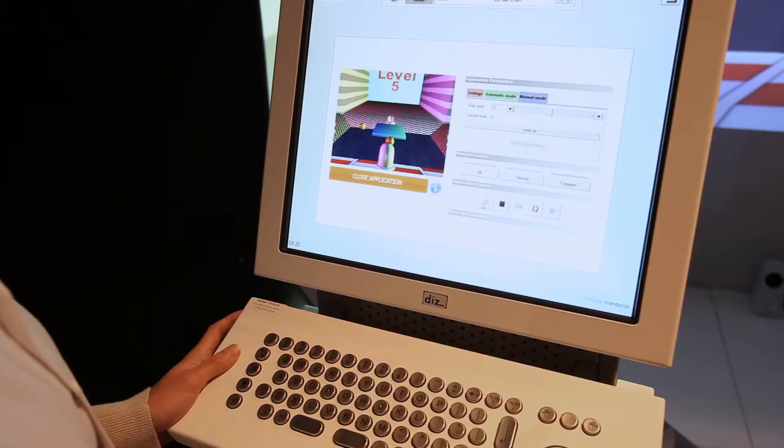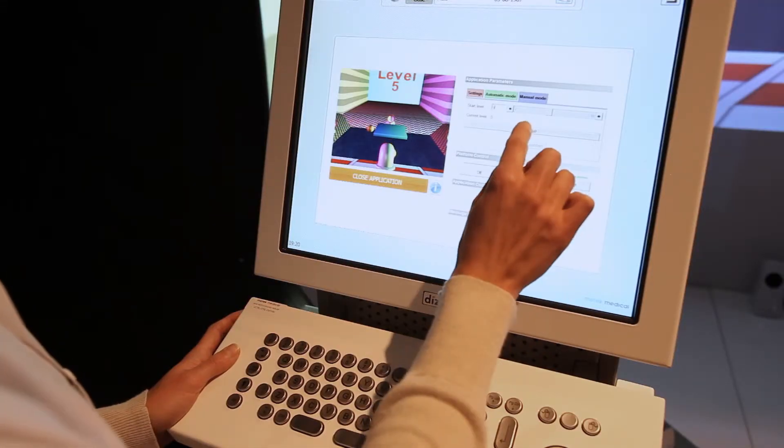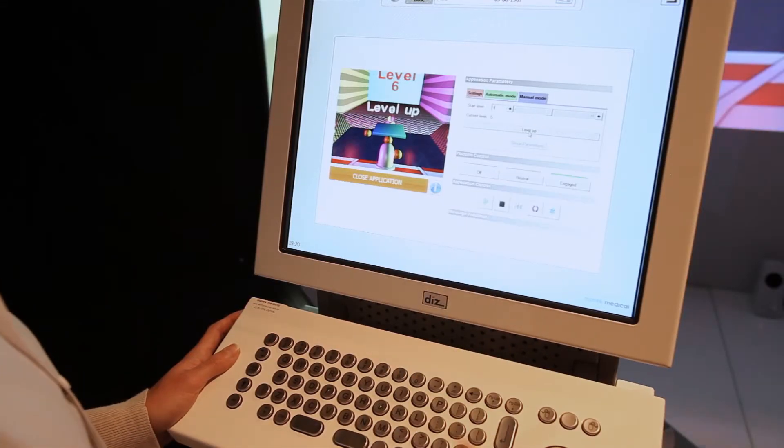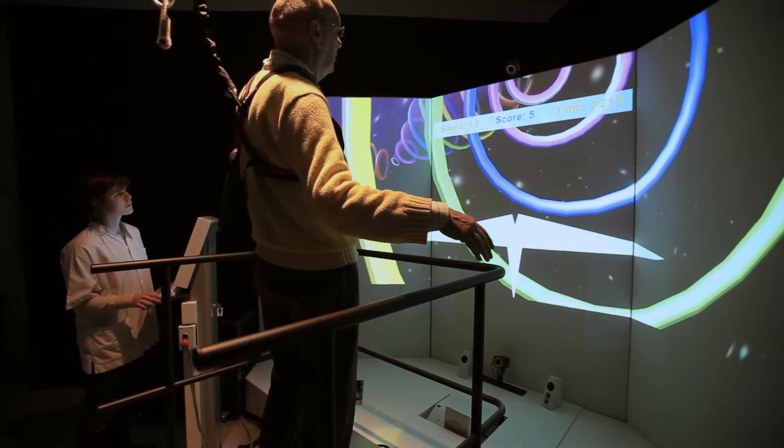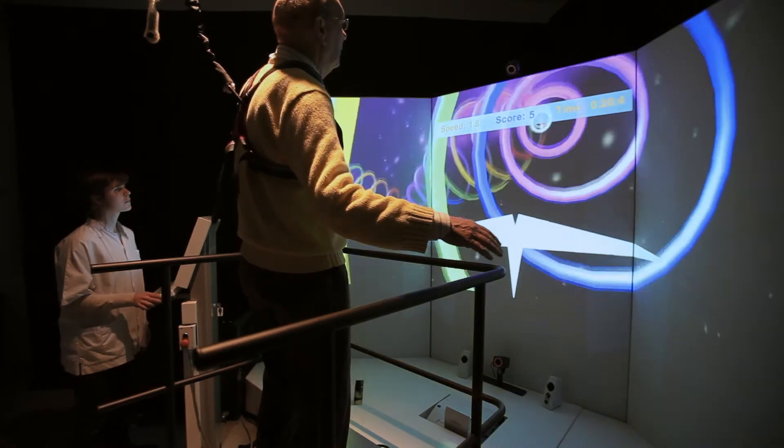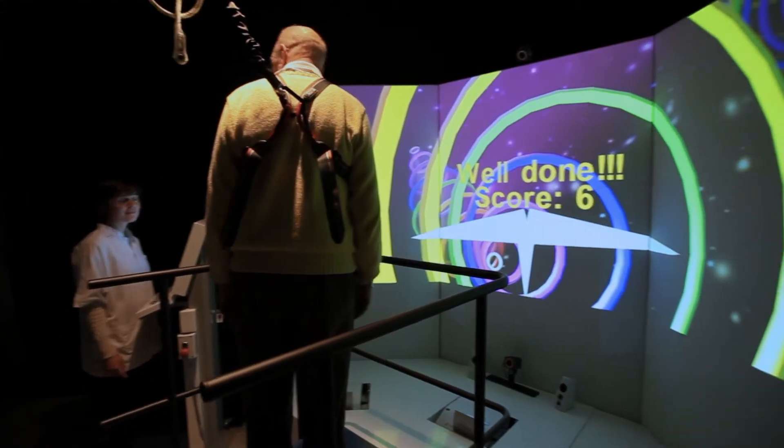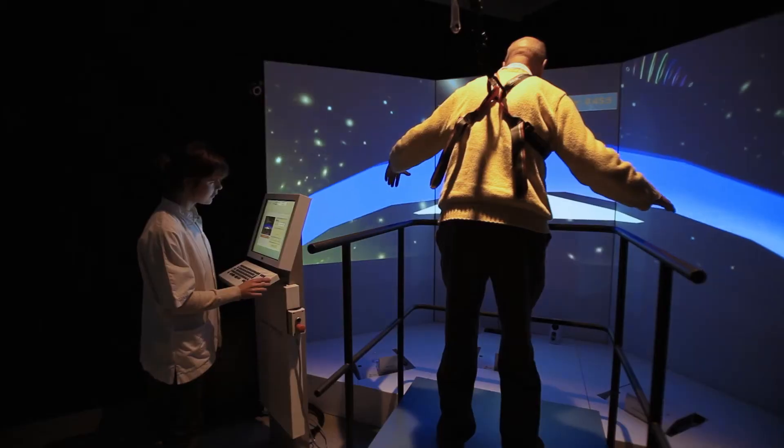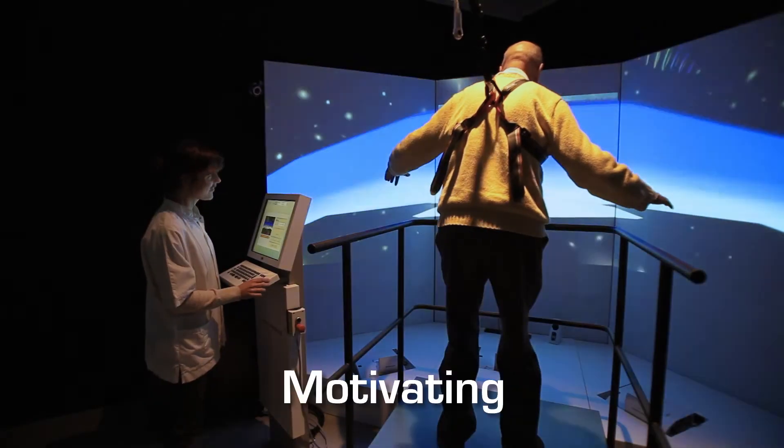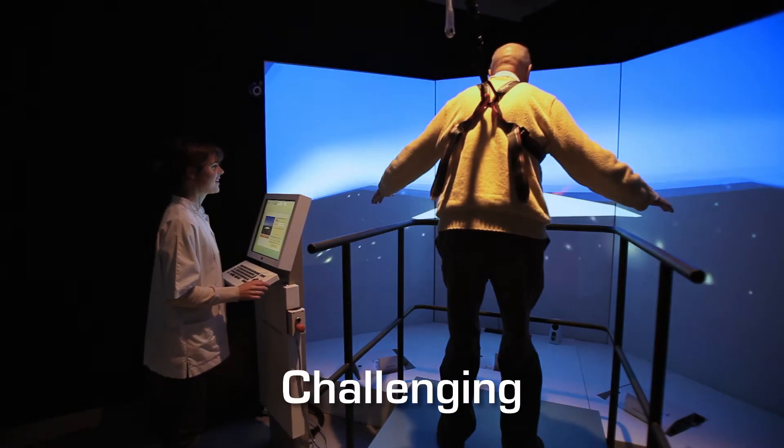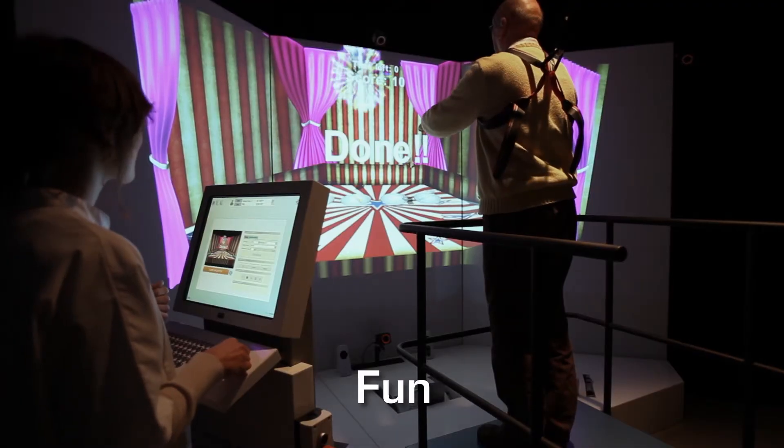The therapist can adjust the intensity of the training at any point. Training applications incorporate richer virtual reality environments, gameplay and high scores to make the training motivating, challenging and fun.